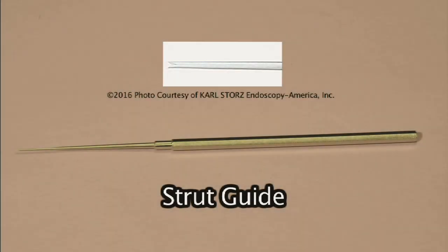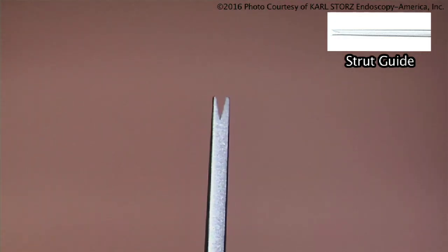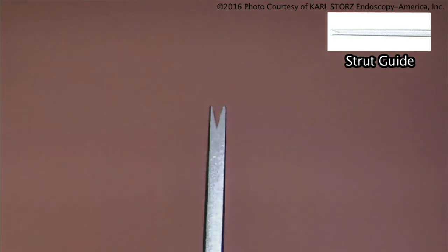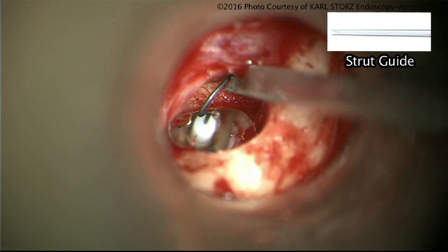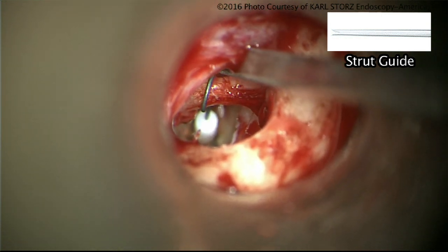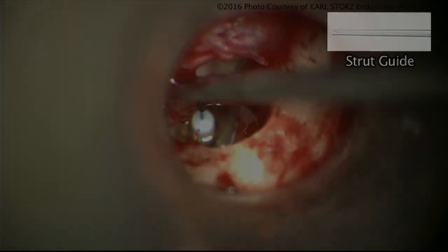The strut guide is used to guide a strut. During the first use of wires for stapes operations, Dr. Howard House had the house wire, and the strut guide was used to guide the curved portion — the crook — of the wire over the incus as it was placed to be crimped in position. The notch was used to engage the curved aspect of the crook, and we still use it for that purpose today in stapes surgery.